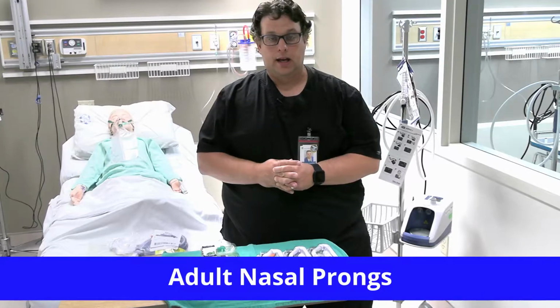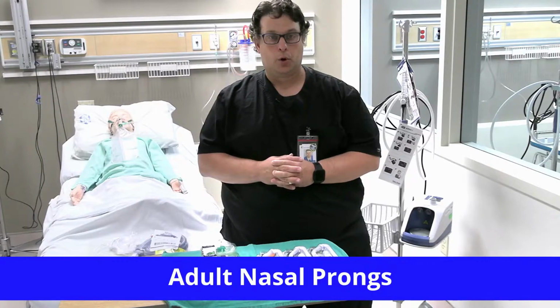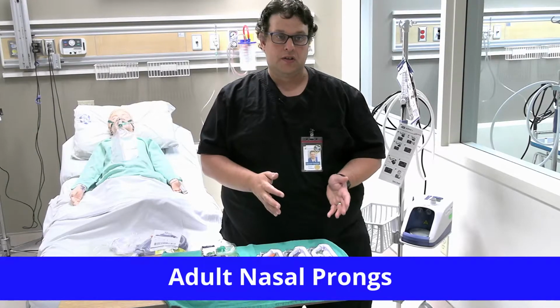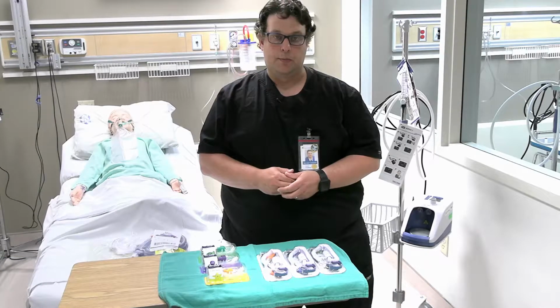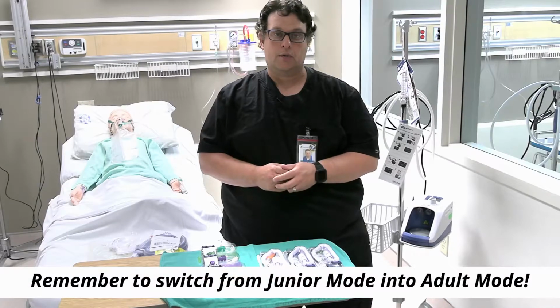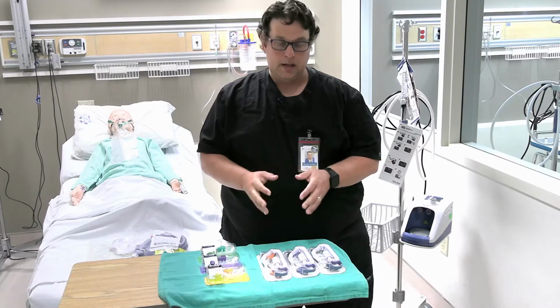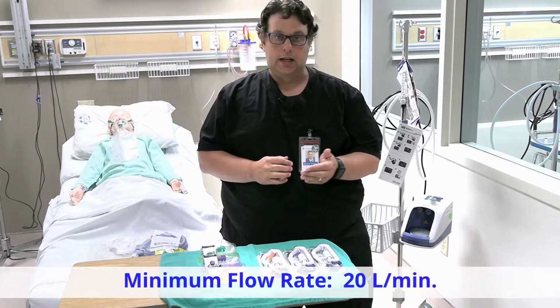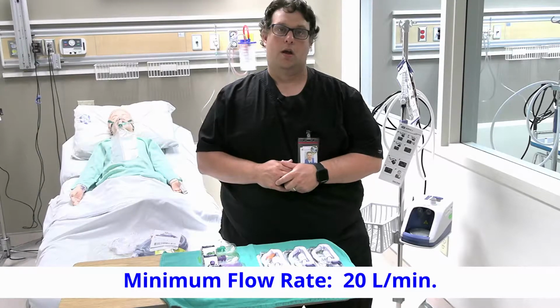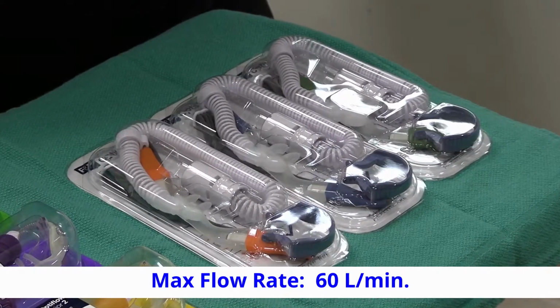If you have a pediatric patient that is a little bit larger and these nasal prongs are no longer appropriate for that patient, we then can move into the adult consumables or nasal prongs. The important key thing to remember here is you have to then switch the AIRVO from junior mode into adult mode in order to meet the flows that these nasal prongs are rated for. So normally 20 liters per minute is a minimum liter flow that you can deliver with the adult prongs, and the high range is up to 60 liters per minute for the adult prongs.